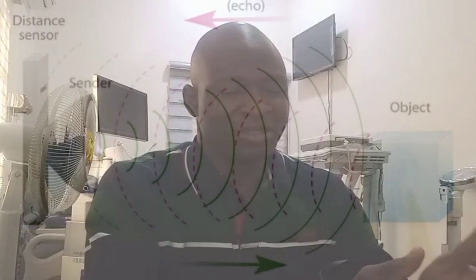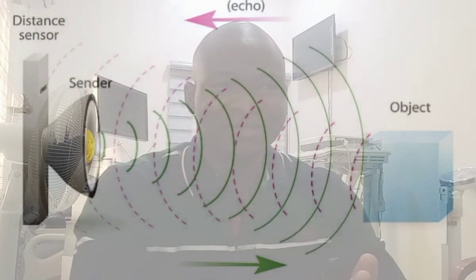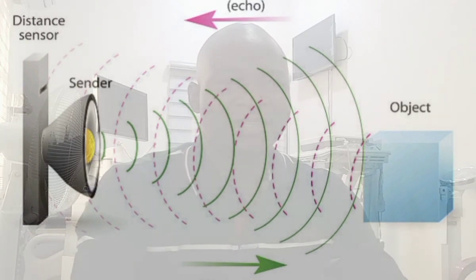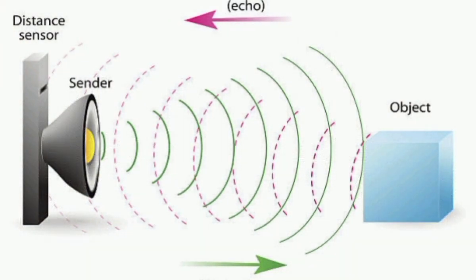The transducer is coupled to the skin with acoustic gel, and the pulse of ultrasound propagates down into the tissue. At the acoustic interfaces in the body, which include specular reflectors and scatterers, a portion of the incident beam energy is reflected and returns to the transducer.